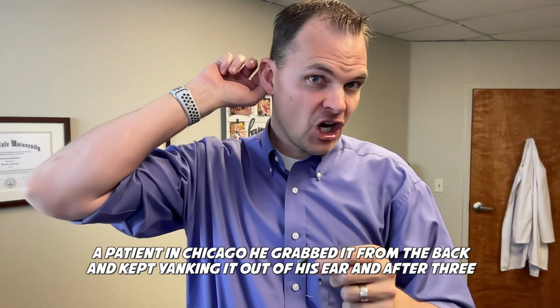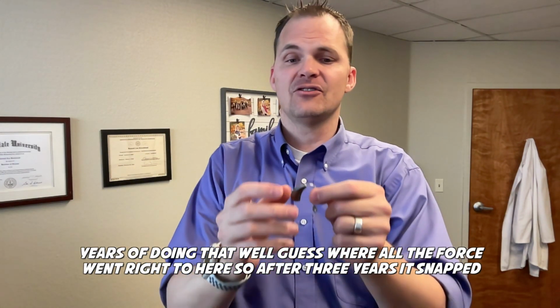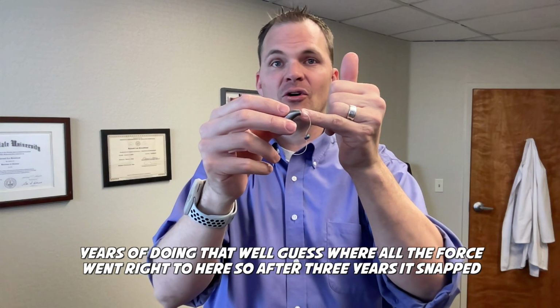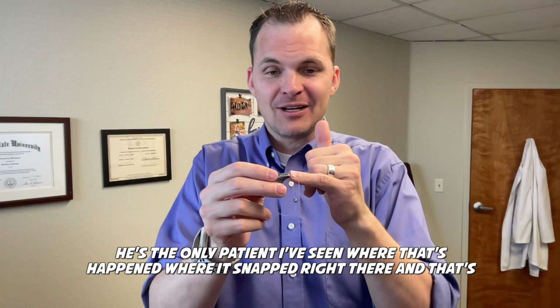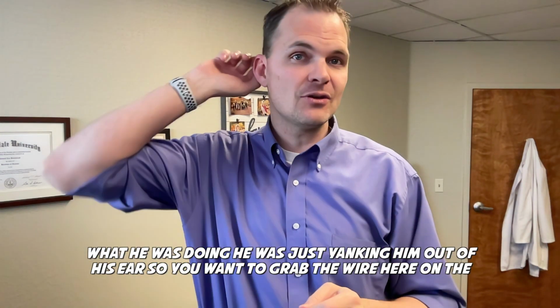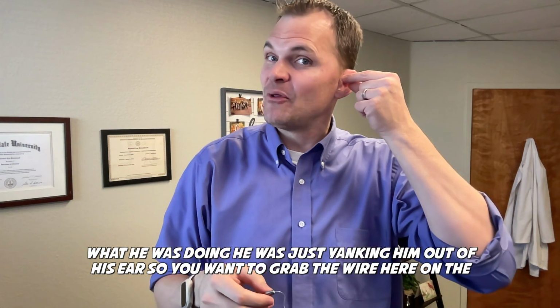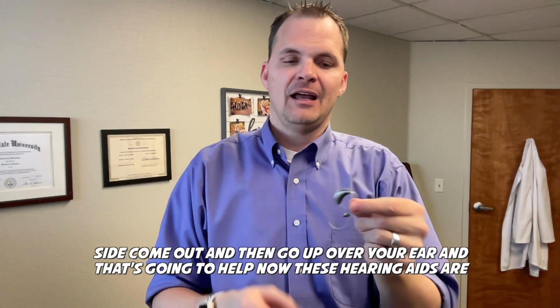I had a patient in Chicago, he'd grab it from the back and keep yanking it out of his ear, and after 3 years of doing that, well, guess where all the force went? Right to here. So after 3 years, it snapped. He's the only patient I've seen where that's happened, and that's what he was doing, just yanking it out of his ear. So you want to grab the wire here on the side, come out, and then go up over your ear, and that's going to help.